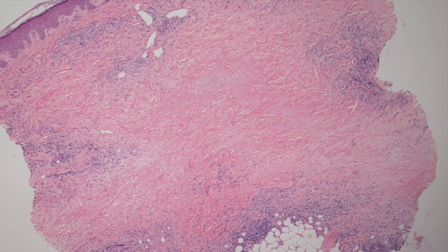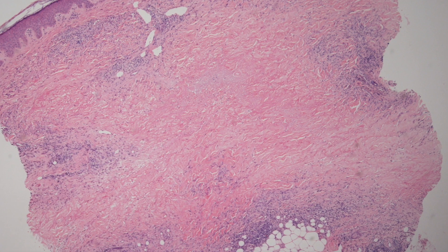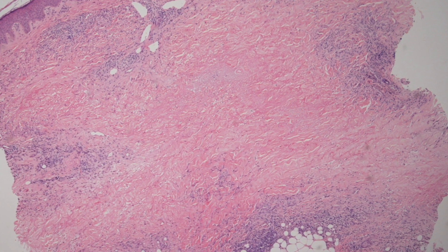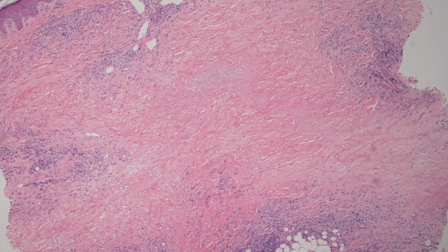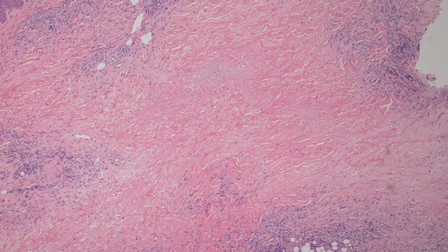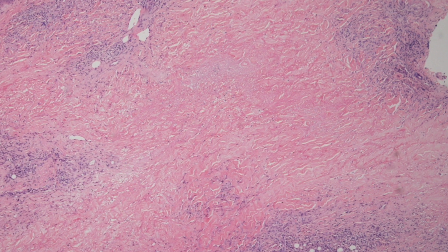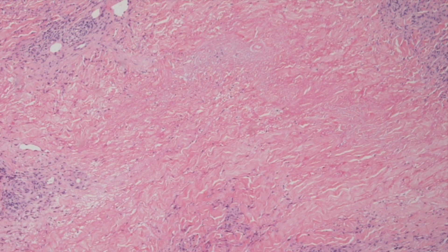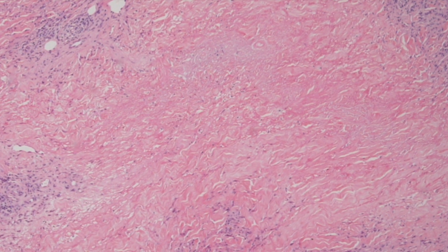On low power, the features of NLD can be appreciated. The central part of the lesion shows rather featureless, deep pink staining or eosinophilic collagen, and at the periphery is the inflammatory infiltrate.